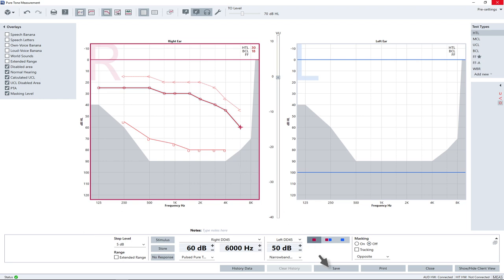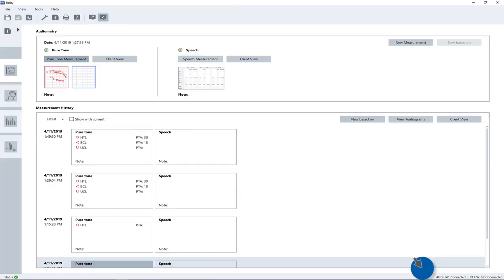After completing the measurements, press the save button. Clicking the close button will take you back to the audiometry main page.